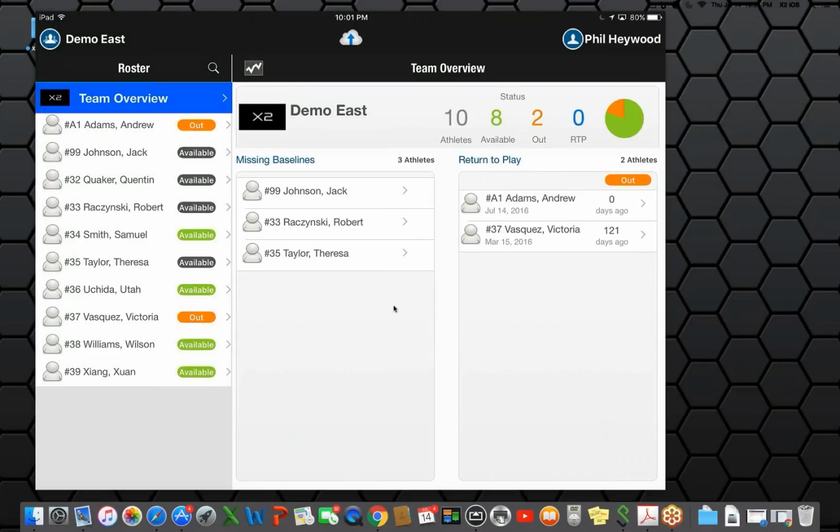Welcome to the X2 Biosystems Integrated Concussion Evaluation Training. Today we'll be going over the Return to Play examination.